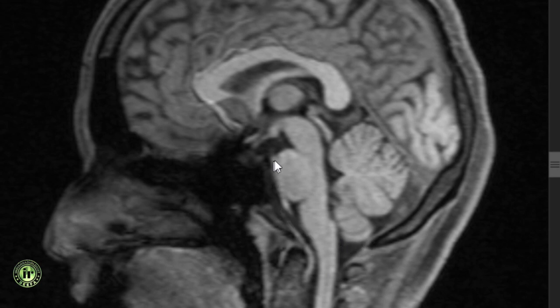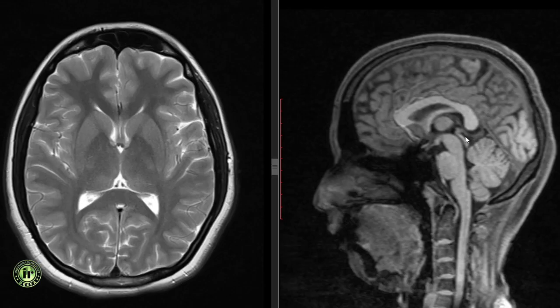The pontine cistern is anterior to the pons and medulla and contains the basilar artery and 5th to 12th cranial nerves. It is continuous with the interpeduncular cistern superiorly and the quadrigeminal plate cistern posteriorly. The chiasmatic or suprasellar cistern extends from the infundibulum to the posterior surface of the frontal lobe and contains part of the sylvian fissure and the circle of Willis.